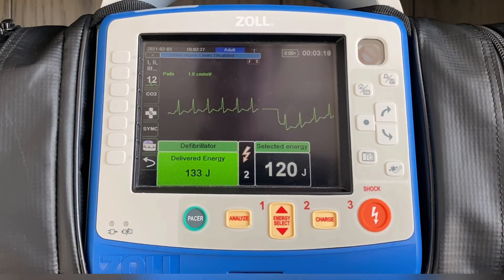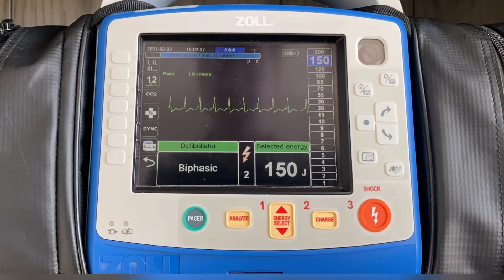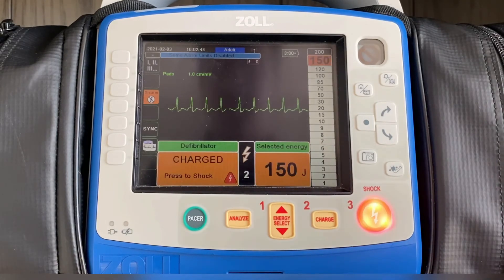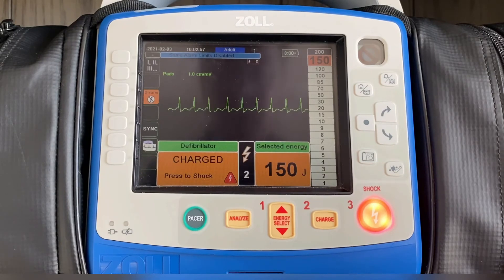Now let's say hypothetically that didn't work again. We're now going to cardiovert at the next energy level up, 150 joules. So we go in, press energy select, 150, and charge the device. In this case, you'll recognize the fact that I did not hit the sync button prior to selecting the energy. The monitor says "defibrillator" — so this patient that you have sitting there talking to you, about to be cardioverted, in this case will be defibrillated instead.